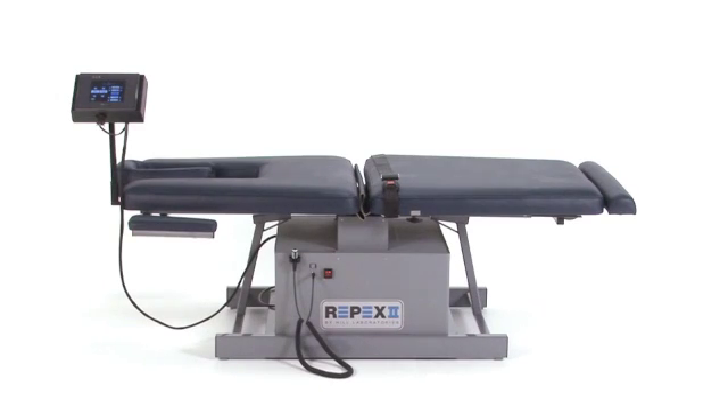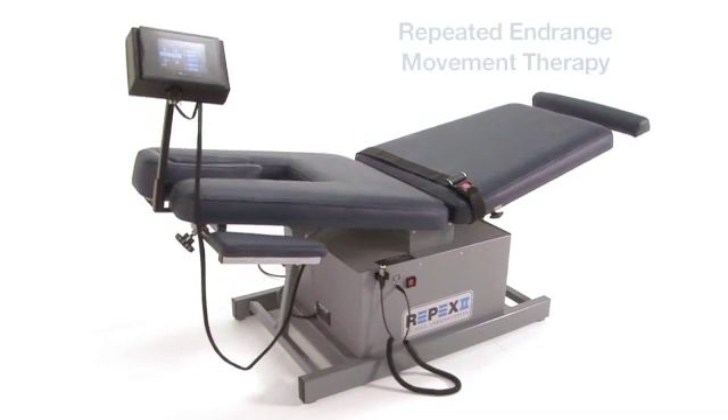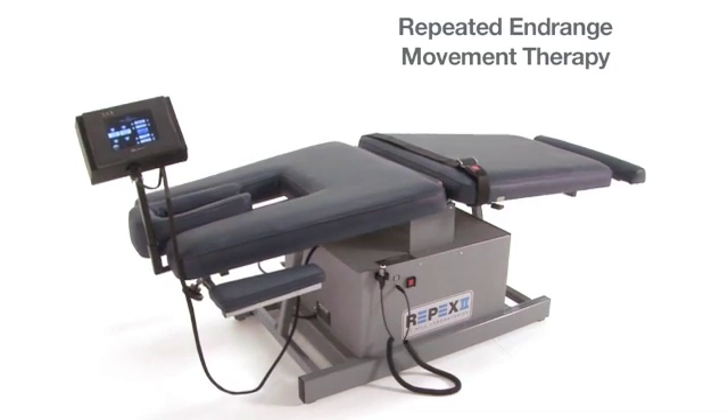Hill Laboratories and Robin McKenzie developed the REPEX model to enhance the effectiveness of repeated end-range movement therapy for mechanical disorders of the lower back.